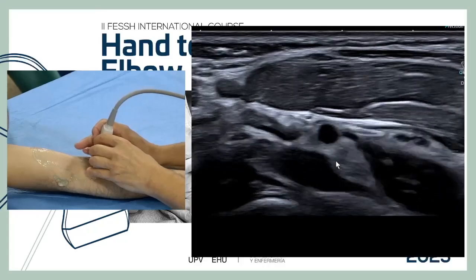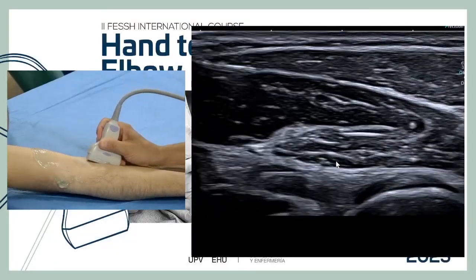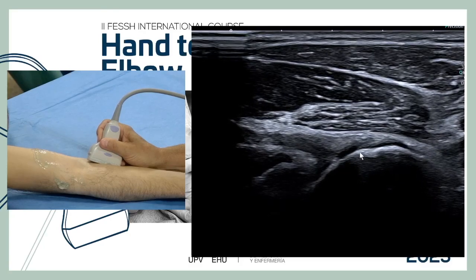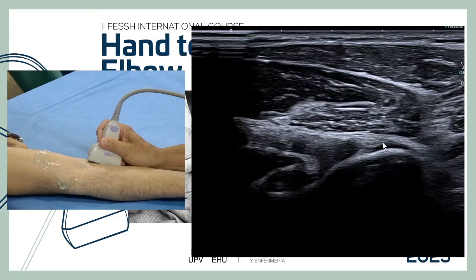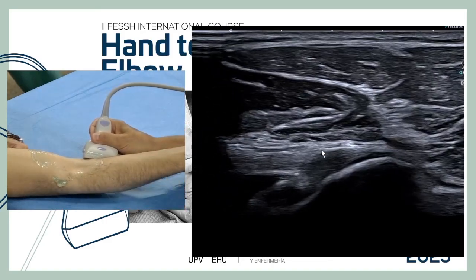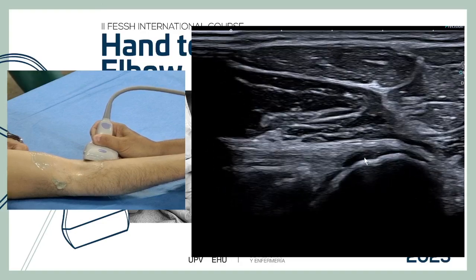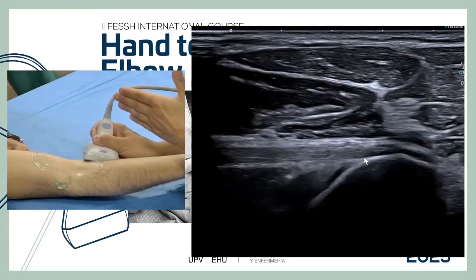Regarding which head tears more often — sometimes long, sometimes short. We make an oblique coronal view, trying to get the tendon really parallel. We need to see the entire tuberosity: the proximal part of the insertion is the long head, and the short head is the distal one. We flex a little to get the tendon as parallel as possible to the transducer, then check from medial to lateral to assess both heads.